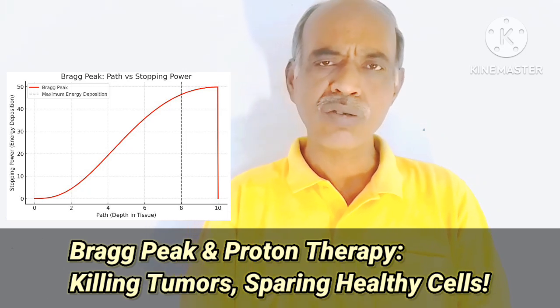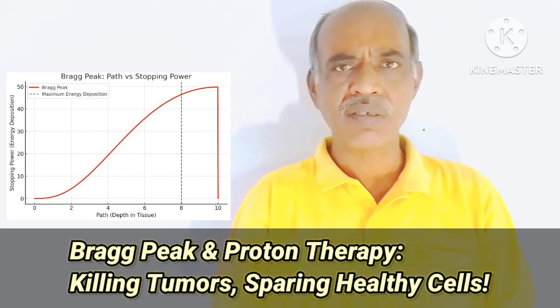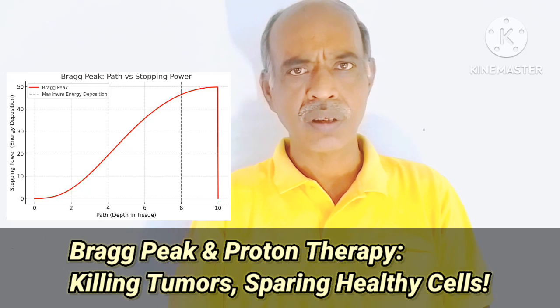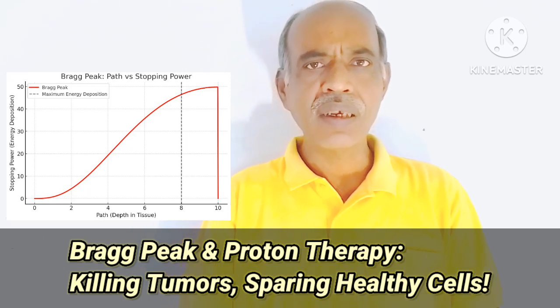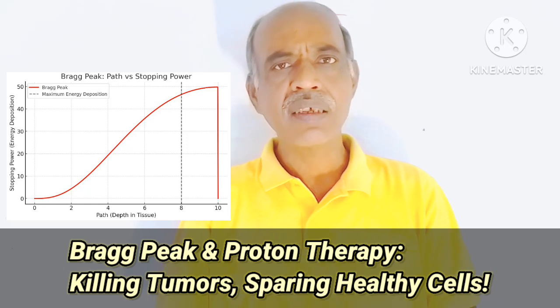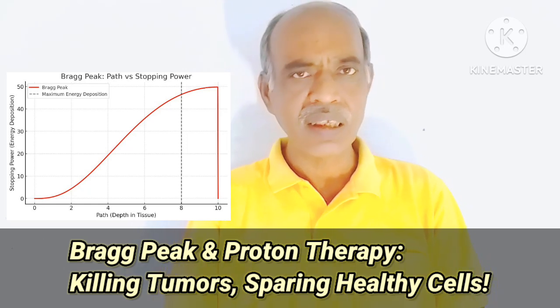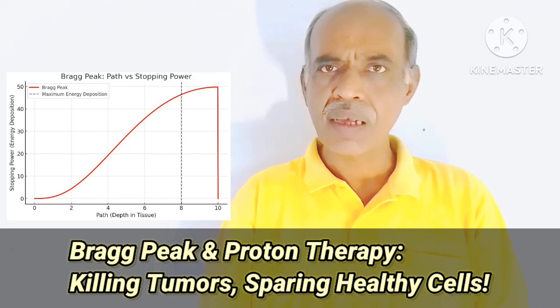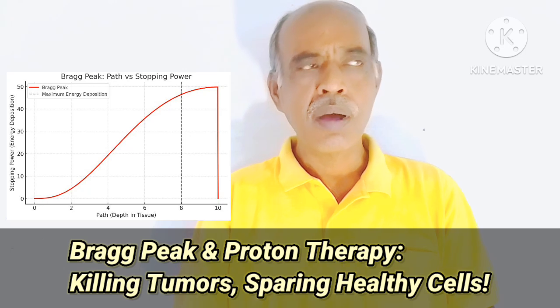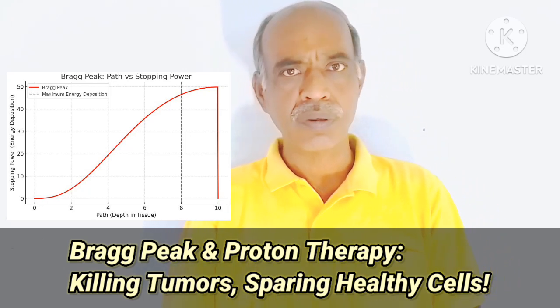X-ray radiation is also used to treat cancer, but there is a problem with X-ray radiation. X-ray radiation moves throughout your body. So, while it is treating the cancerous cells or the tumors, at the same time it is damaging your healthy tissues. But in the case of proton therapy, targeted treatment is possible.